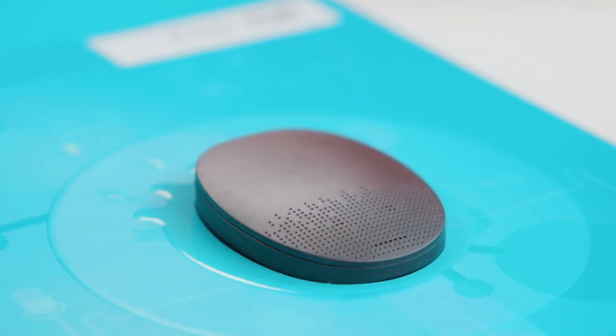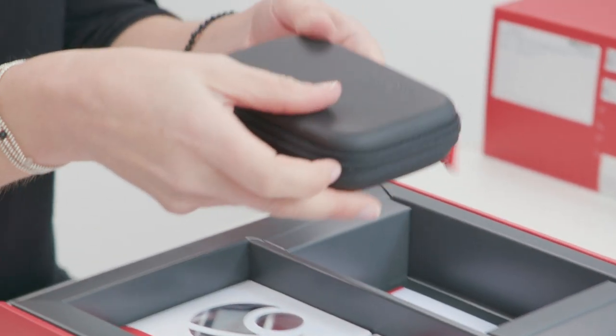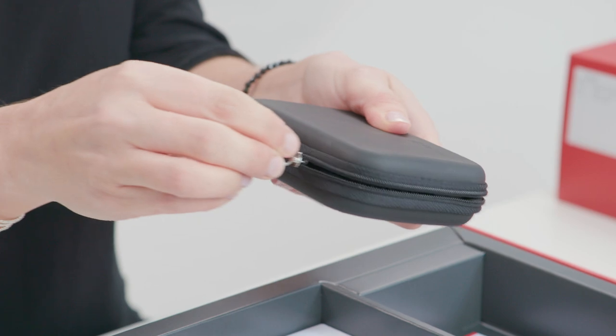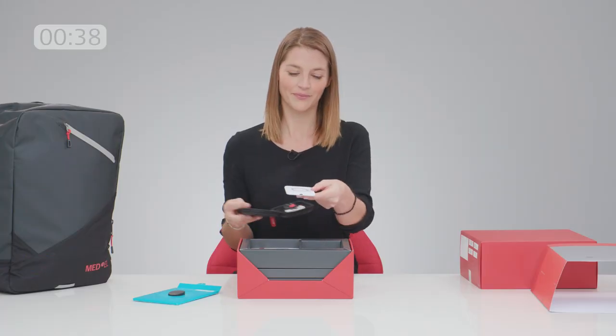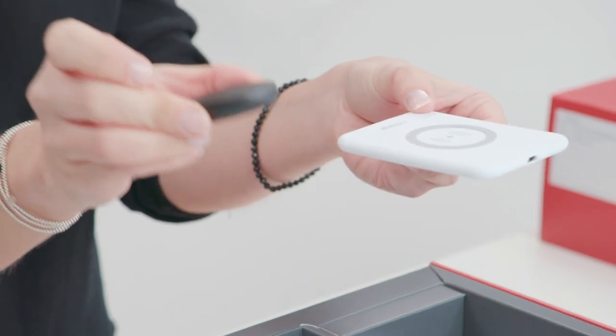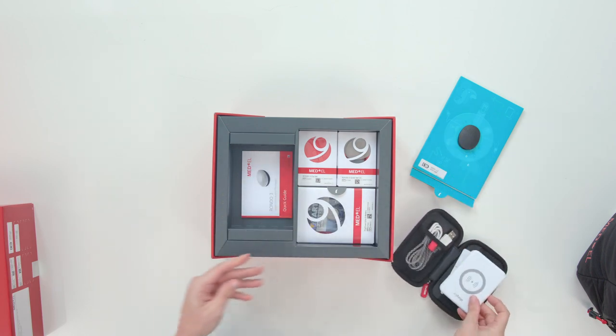You don't even need a cable to charge the Rondo 3. That's thanks to the wireless charging pad, which is in here. Just place the processor in the middle of the pad for a few hours and the Rondo 3 is ready for a full day of hearing.